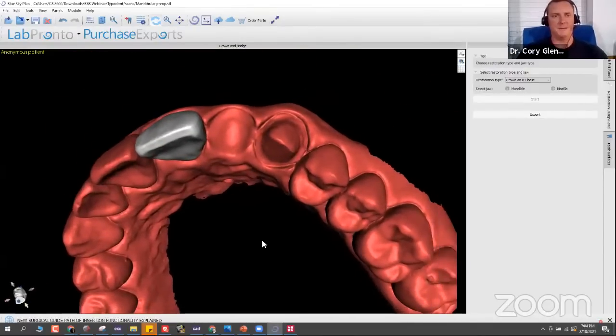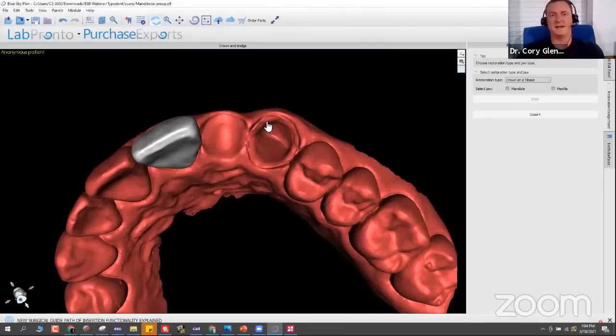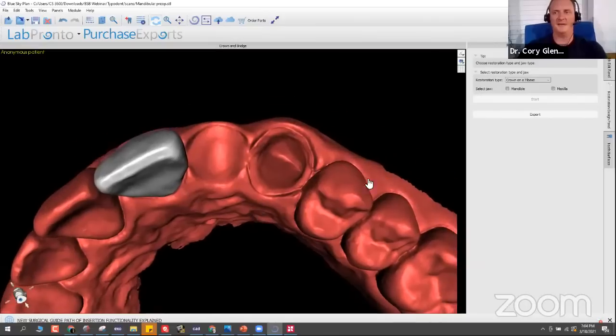Now would be probably a good time to go ahead and answer some other questions, because I'm going to do the exact same process here as I talk on these two teeth. I'm just drawing a margin, making the crown bottom, finalizing the crown and cutting away intersections. So I've probably got a good 10 minutes here that I could answer questions, Michael, if there are more.